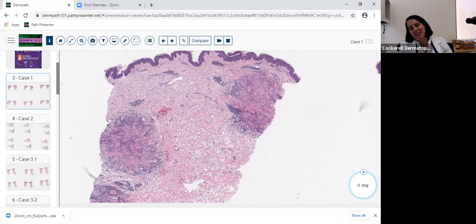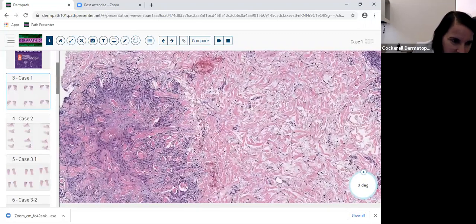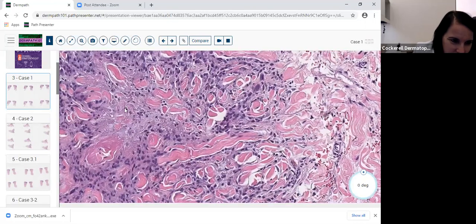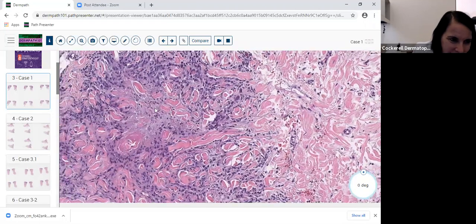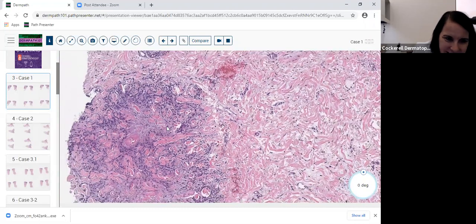Now, why isn't this infectious? Why wouldn't you do special stains on this? You could do special stains. You might not believe that that's mucin in the center. So what I would do is look for organisms anyway. I'd say, well, am I 100% convinced that's mucin in the center, this feathery bluish area? Not 100% convinced, and maybe this palisade isn't very well formed. It's not forming a good picket fence look. So I might think, well, maybe this is infectious.